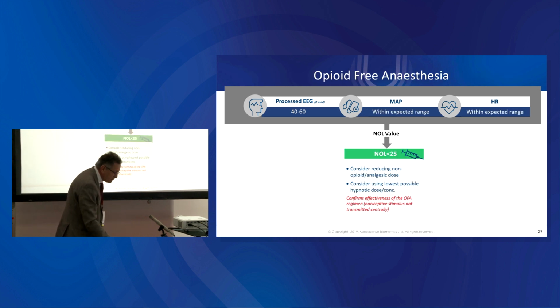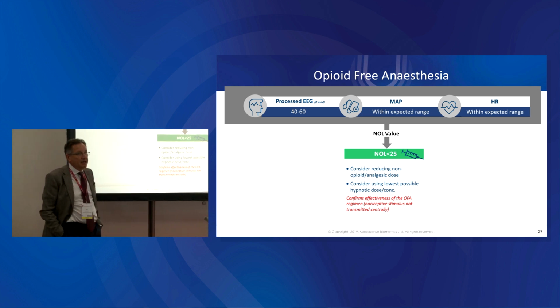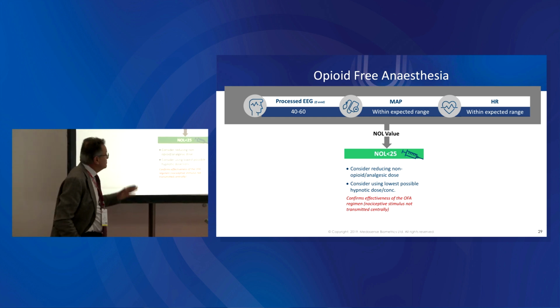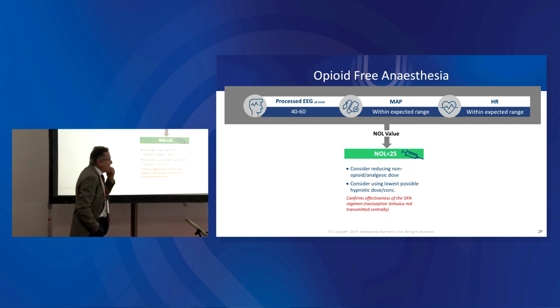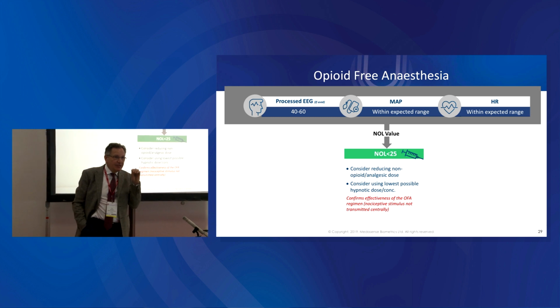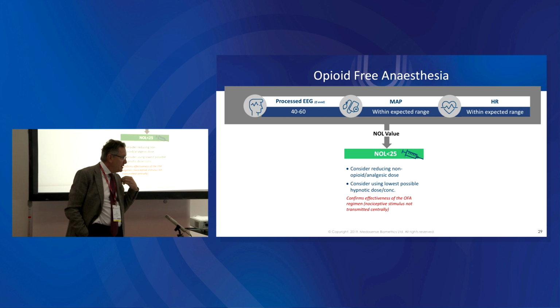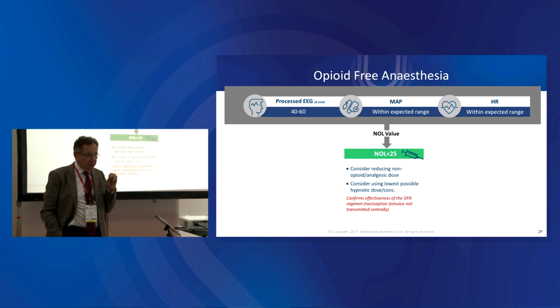So, if you believe that opioid-free anesthesia is going to be part of the landscape, I don't know, possible. Well, then we basically take away all the clinical reasoning on hypnotic-opioid interactions, which we now understand we can describe, and go for a cocktail that we do not understand in terms of interactions.